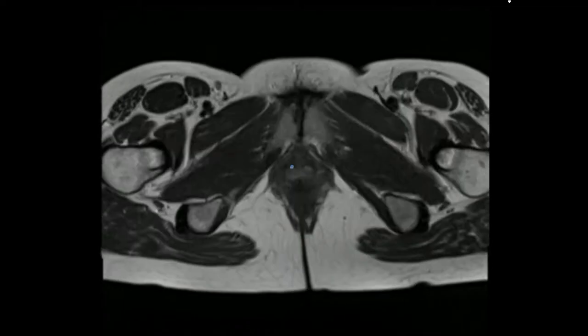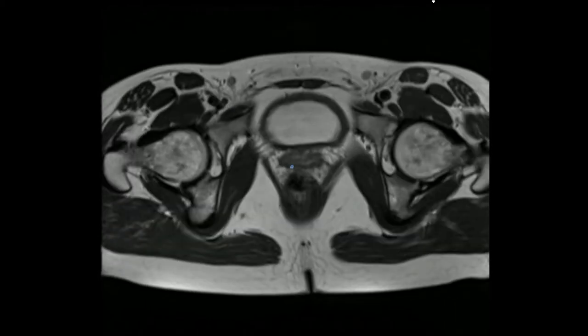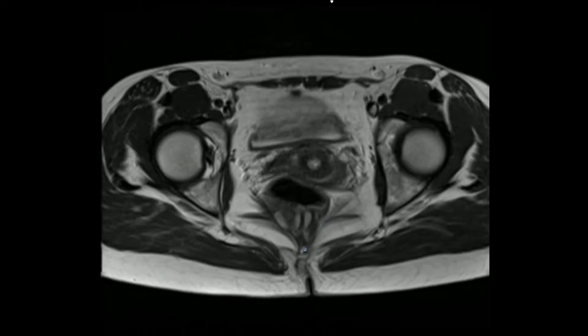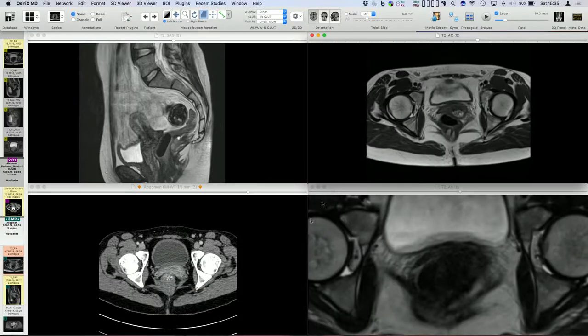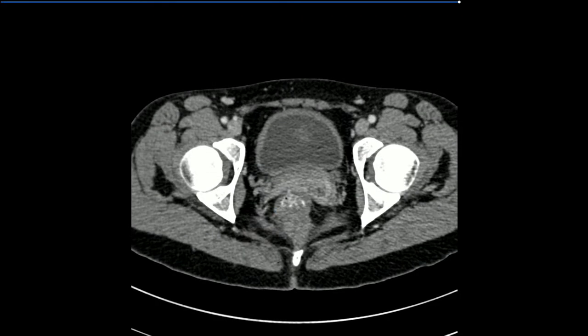Also, when you look at the transverse image, you see there cystic retrorectal aspect here, a thickening. It's also a thickening. It's not clear if it's in the rectum or it's in the levator ani. You see here, the closer we go to the tip of the coccygeal bone, you see there's more and more cystic mass. So we also did perform a CT, and you see it's the same. We have here the tip of the coccygeal bone and this thickening with the levator ani, and it's in continuation with the anal canal.